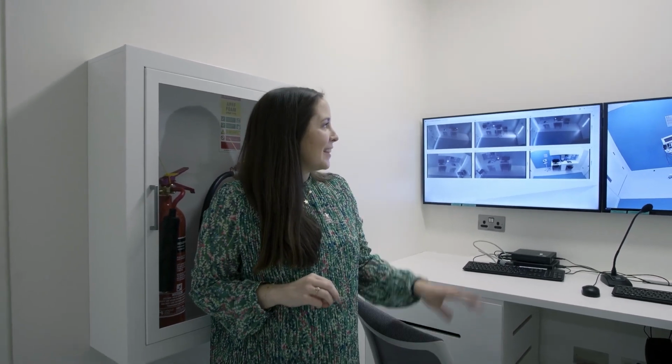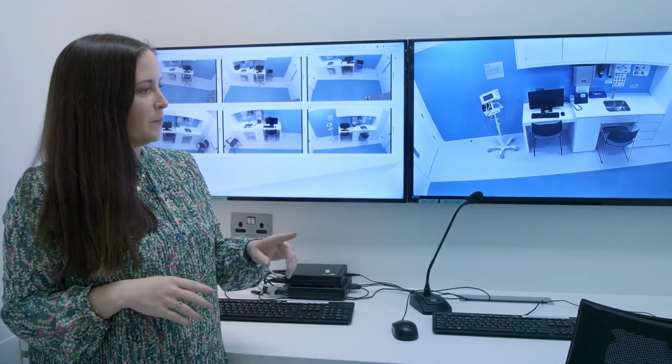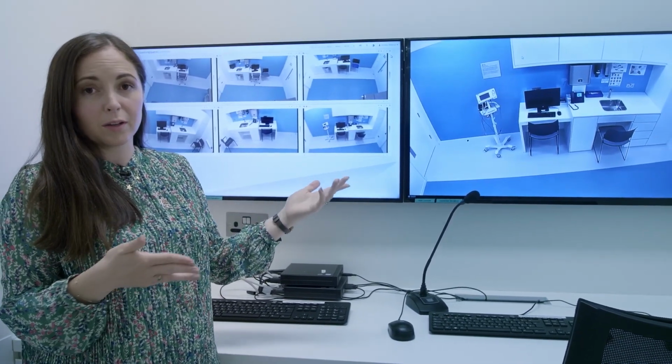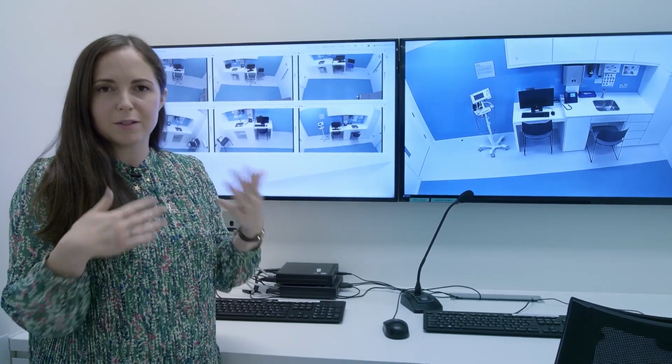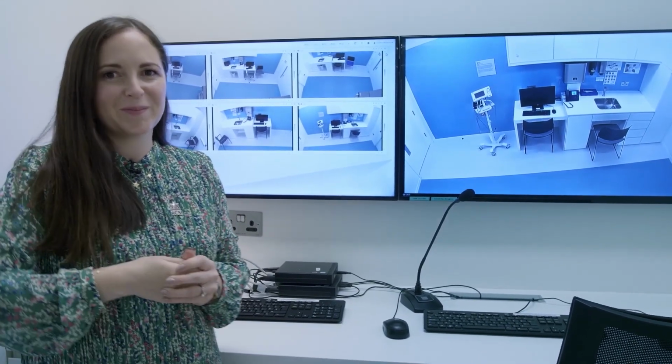So I'll just show you here, this is our control room, so our central area, where we have a dedicated team of specialist technicians that work with us. You might meet some of them later. And they manage Learning Space, which is our learning management system. So this is CAE Learning Space, our learning management system, and this is our control area. So as you can see here, faculty or other team members, other students can observe the students in the room and how they interact with the patients whilst they're in there, depending on what activity they're doing. But we can go in and take a closer look.